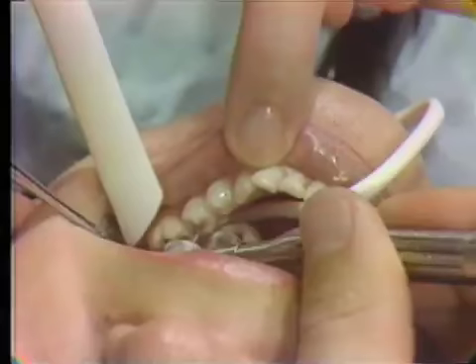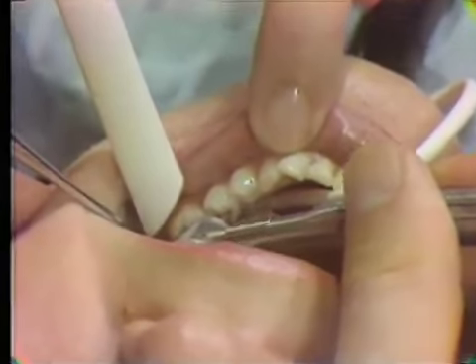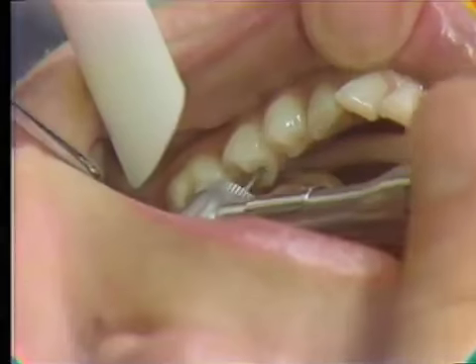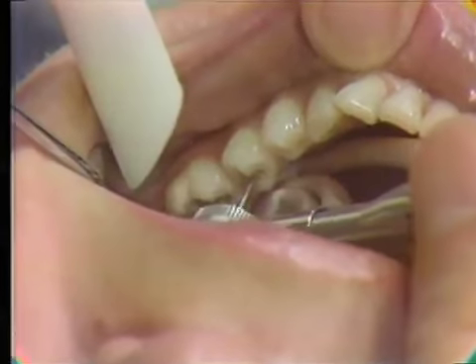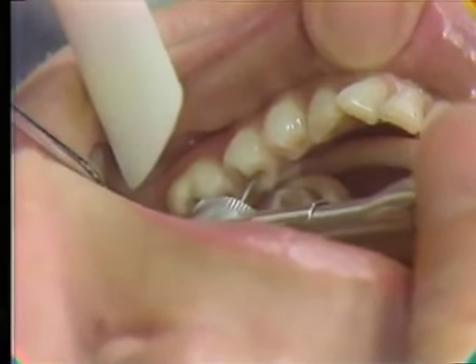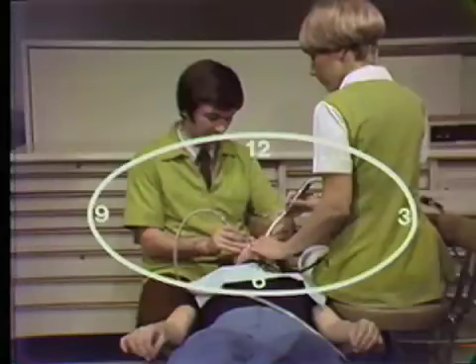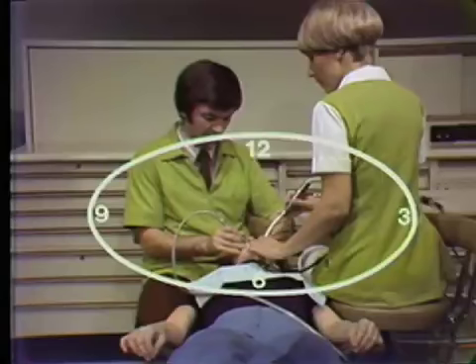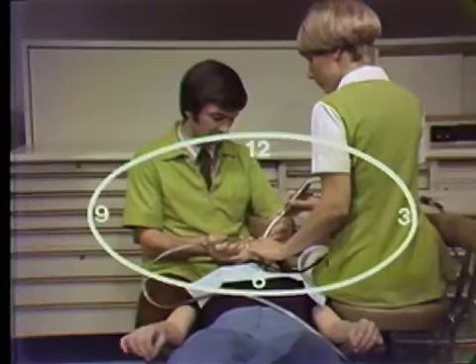Direct vision is used predominantly during the preparation of teeth using the occlusal approach. However, indirect vision is frequently used for close inspection of the prepared cavity. The operator can work comfortably from the 11 o'clock position. The patient is positioned in either a supine fashion or angled slightly upward for improved visibility. The patient's head should be turned slightly toward the operator with chin elevation as needed to improve access.